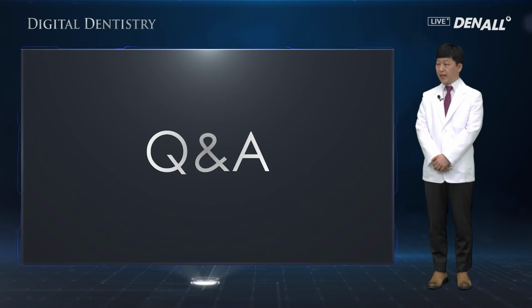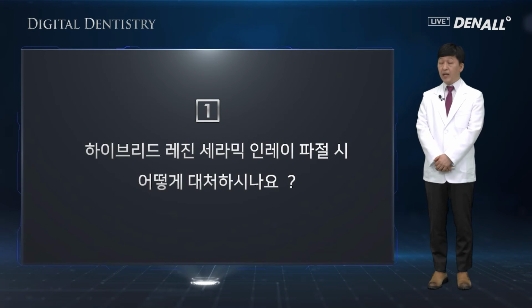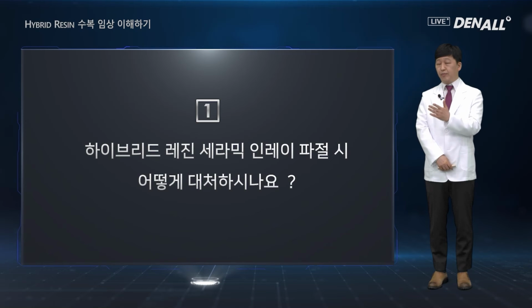Q&A session will be held. First, the question. How do you respond to hybrid resin ceramic inlay fracture? In most cases, fracture occurs in the proximal case.